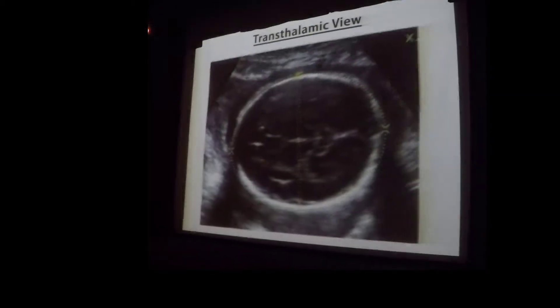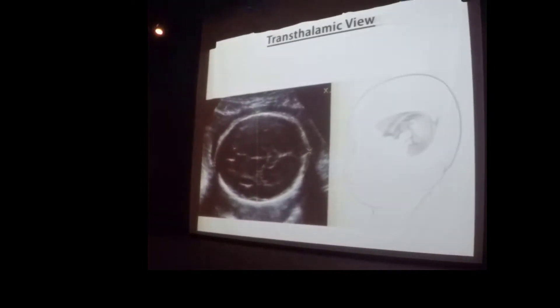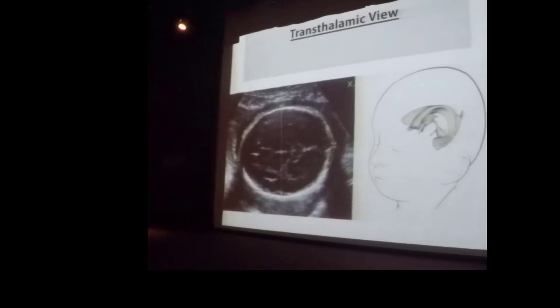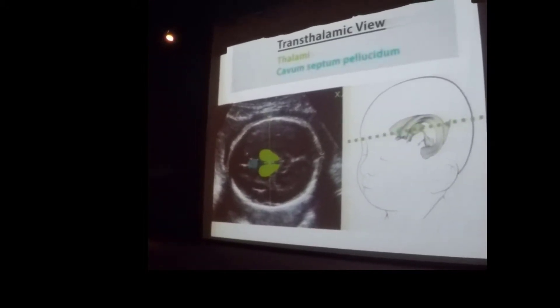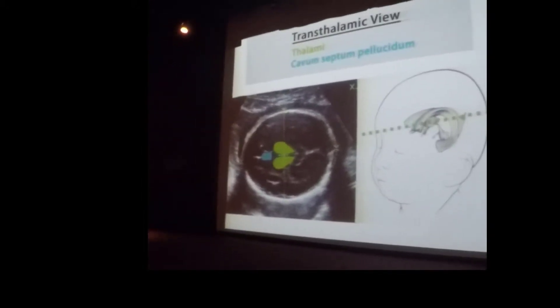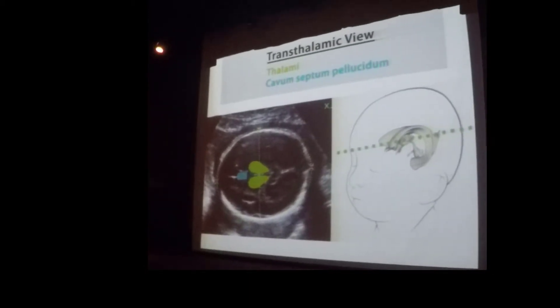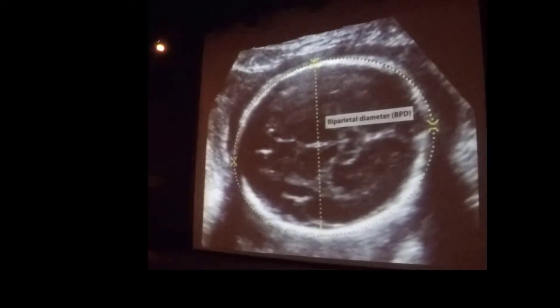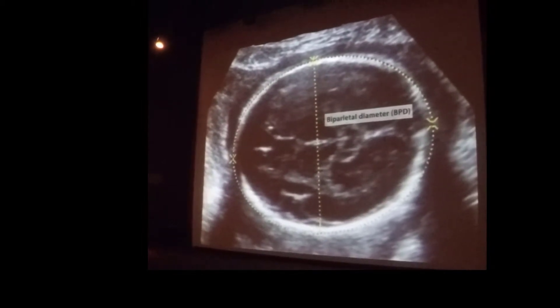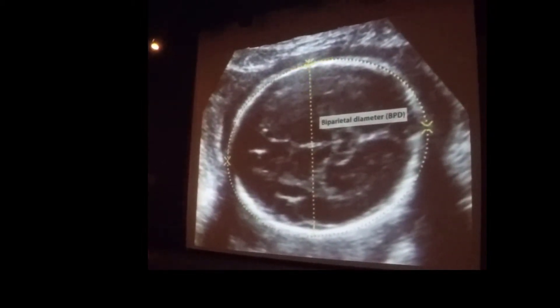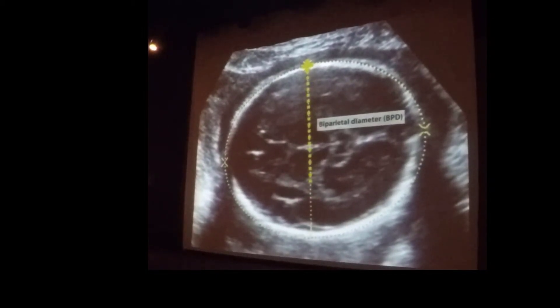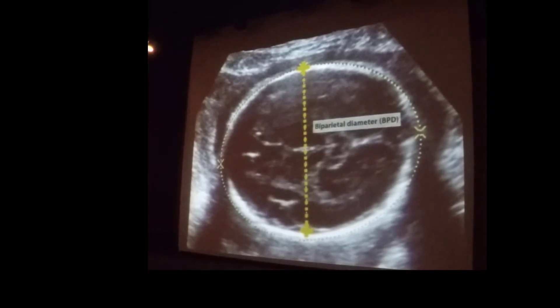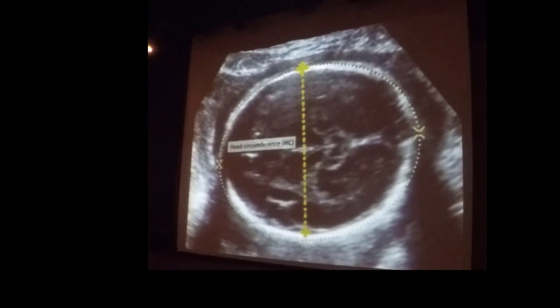Sonographic head measurements are obtained in the transthalamic view, which is an axial or transverse image of the fetal head. The thalami and cavum septum pellucidum are important landmarks in this view. The biparietal diameter is measured perpendicular to the sagittal suture, from the outer edge of the skull in the near field to the inner edge of the skull in the far field. The head circumference is measured by placing an ellipse around the outer edge of the skull.